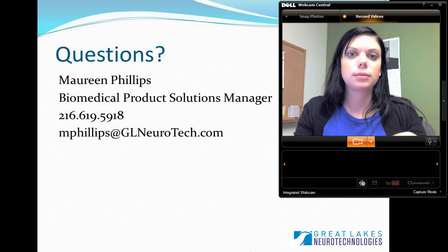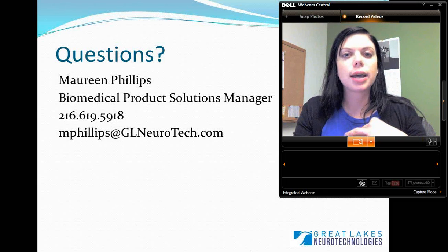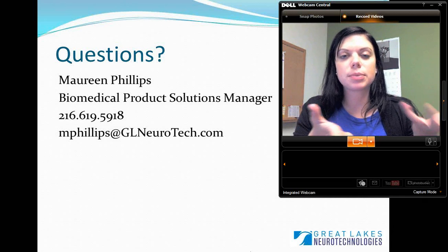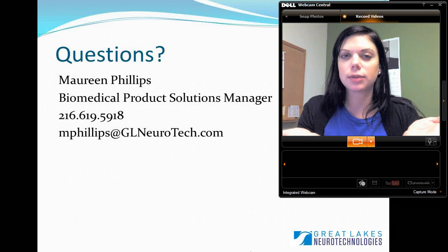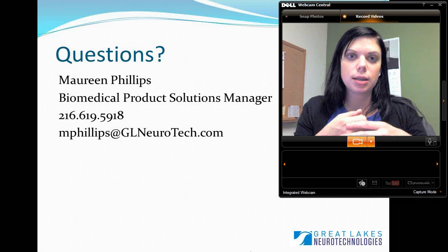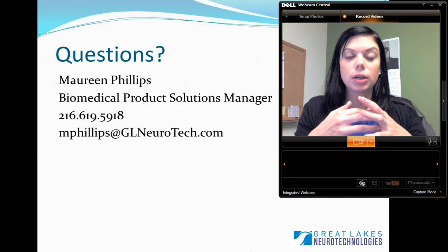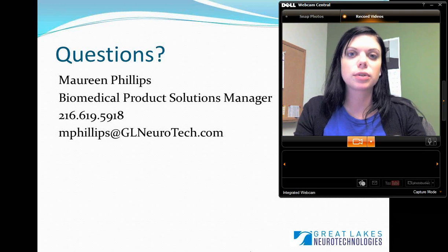Okay, what is the max sampling rate per channel? The maximum is 960 hertz, and from a lot of the reading that I've done, usual sampling rates for EEG can range anywhere from 250 to 500 hertz, so we provide ample sampling rate for that. If you're also looking at something like evoked potentials, and you need a very quick response time, the 960 hertz sampling rate is definitely efficient for that.